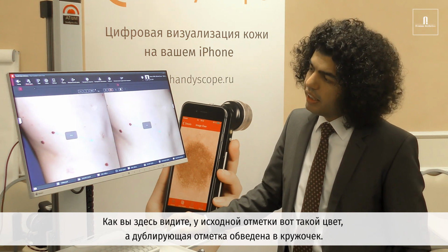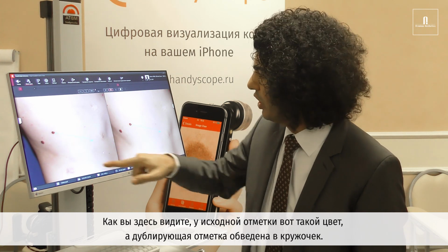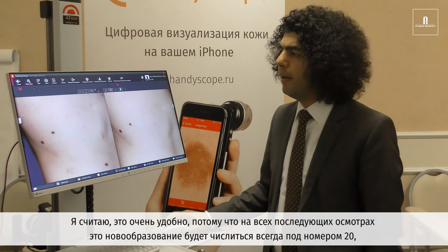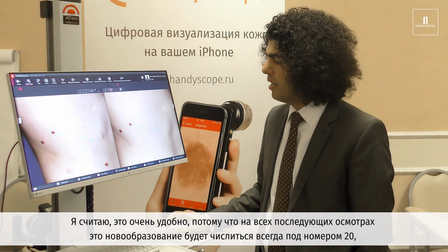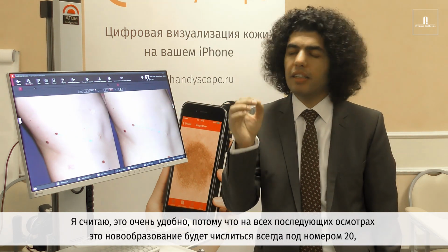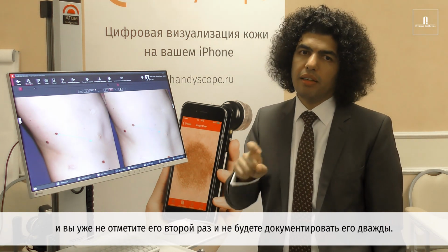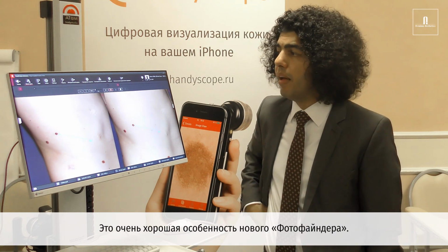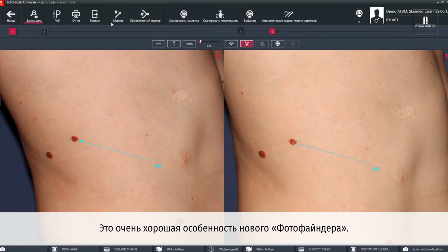So when you see the original marker has always this color of the flash, and the clone marker has the circle. In my opinion, it is very important that this is like this, because in all the continuous follow-ups, you will find this lesion as number 20, and you will not basically mark it twice and be documented twice. This is a great feature which happened into the new FotoFinder.